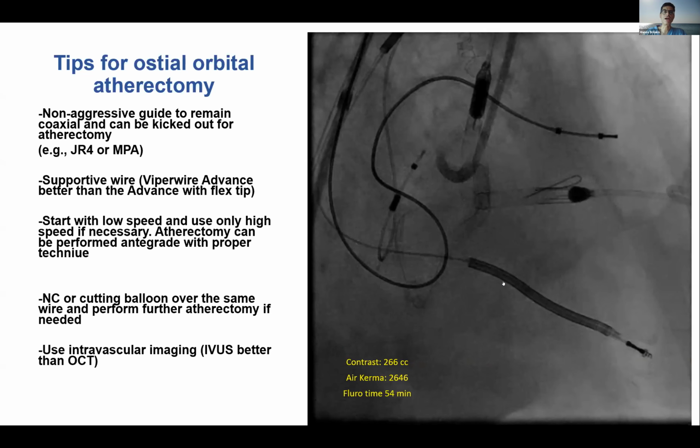The second is how fast you can deliver the covered stent. If it's proximal and there's not much calcium or other problems, and you are fairly confident you can deliver it very quickly, then maybe you don't necessarily need to go for the ping pong technique and deliver through the same guide. That's actually an area where the 8 French guides are very useful. If you have an 8 French guide, you can deliver the covered stent, Papyrus specifically, and a blocking balloon. So you don't need to get a ping pong. You can do everything through the same 8 French guide. But if you have 6 or 7 French guides, then it's much harder. That's where the ping pong comes in.